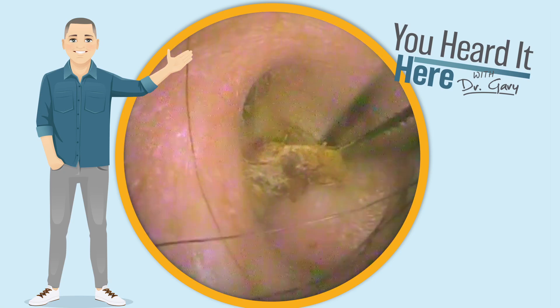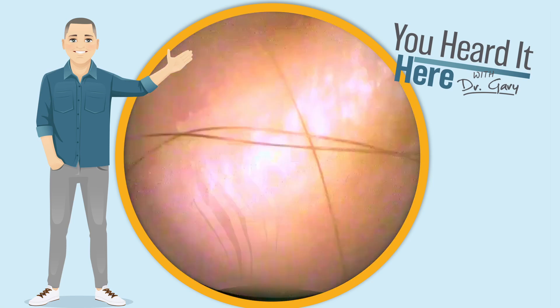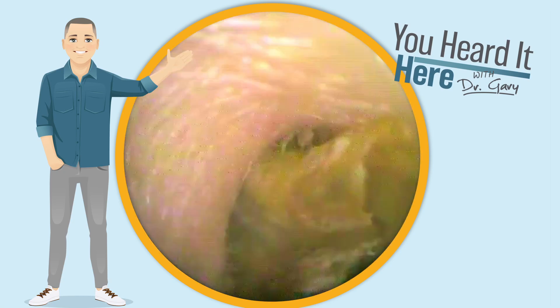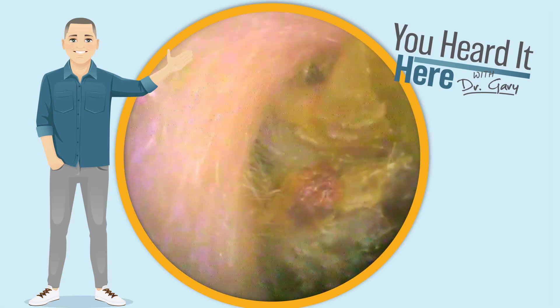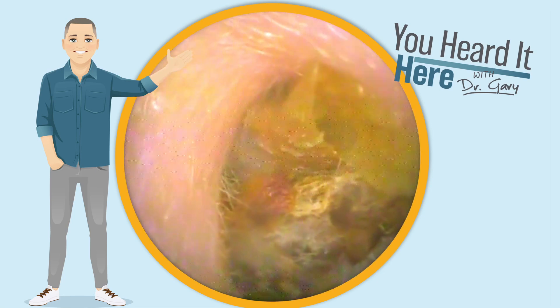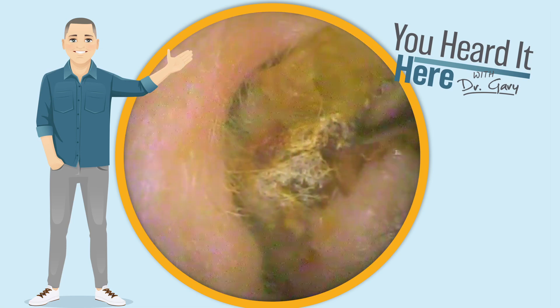This patient also has collapsing canals. As the canals collapse, it kind of pinches the wax and skin back there and really makes it difficult for that wax to naturally come out. Even though the ears are technically self-cleaning, when you do have collapsing canals, sometimes that self-cleaning mechanism doesn't always work.